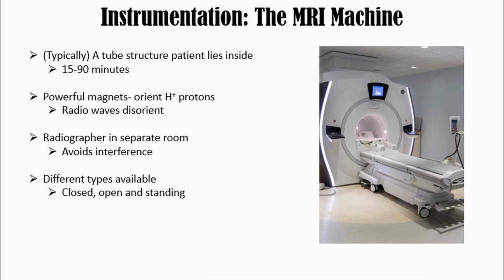There are a number of types of MRI machine, including an open and standing version, but all follow the same concept. As is quite clear in the image here, and from the description, a typical MRI machine is large enough to fit a person inside and then some, and hence a whole large room to itself is required, already something hospitals often cannot give it before even considering cost, which is often astronomical.